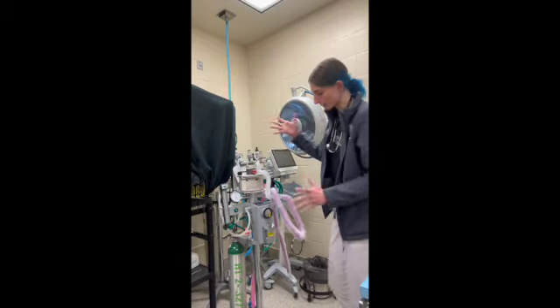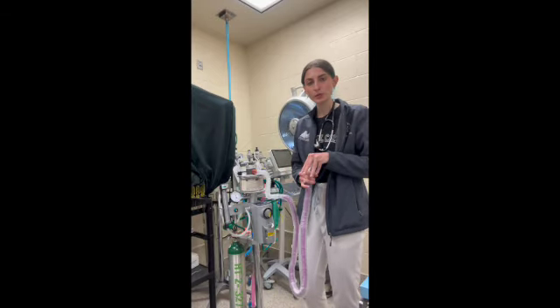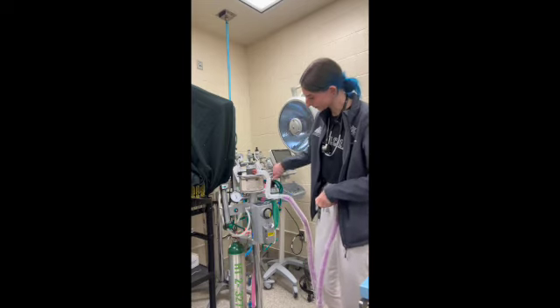All right, so now we're going to perform a leak test on our machine. You want to make sure that you're connected to an oxygen source. You want to occlude the end of your tube. You want to go ahead and close your pop-off valve.